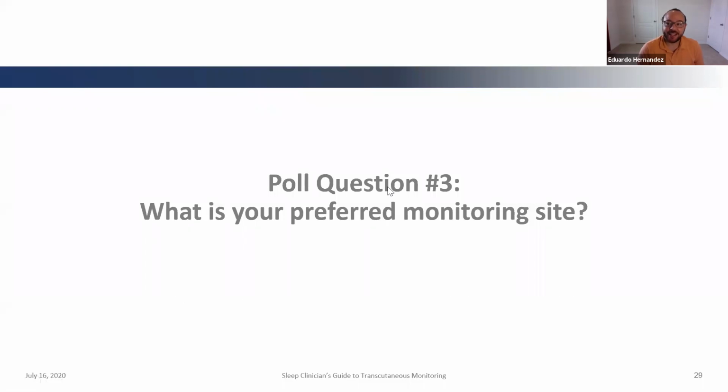All right. I guess I was in the majority here. I hope I didn't sway your voting opinions, you know what I mean? I was worried that if I said that everyone would pick it, but it sounds like the majority is on the same page here. The forehead is exactly what I would see. We see it in our labs as the second. So it's indicative of what I've seen in the labs that I've worked at. Subclavicular first and then forehead second. Yeah, seems about right.